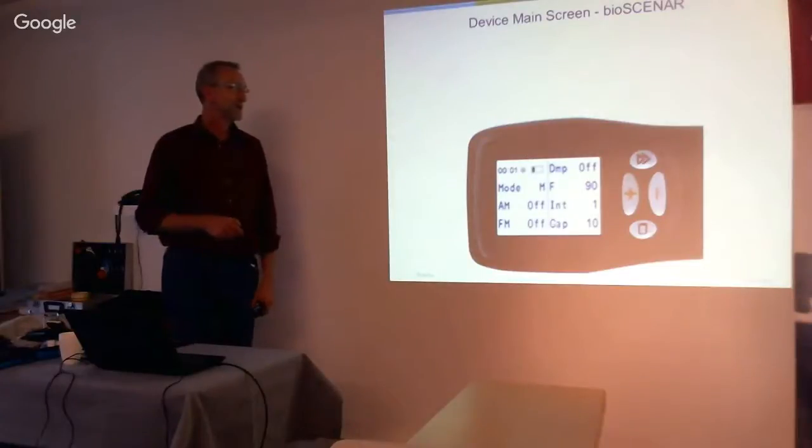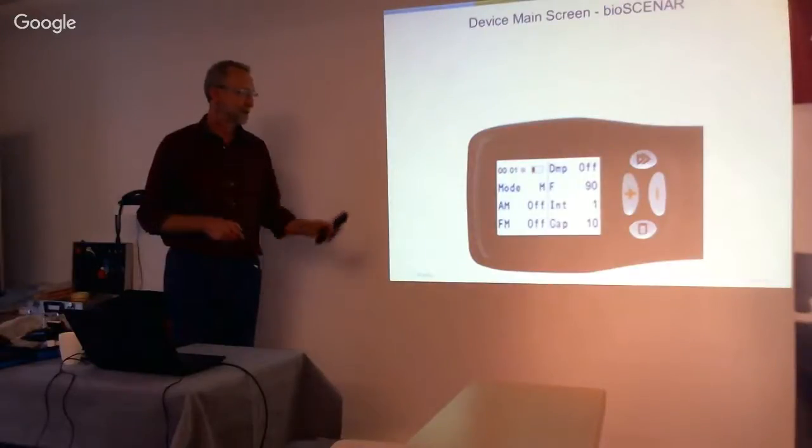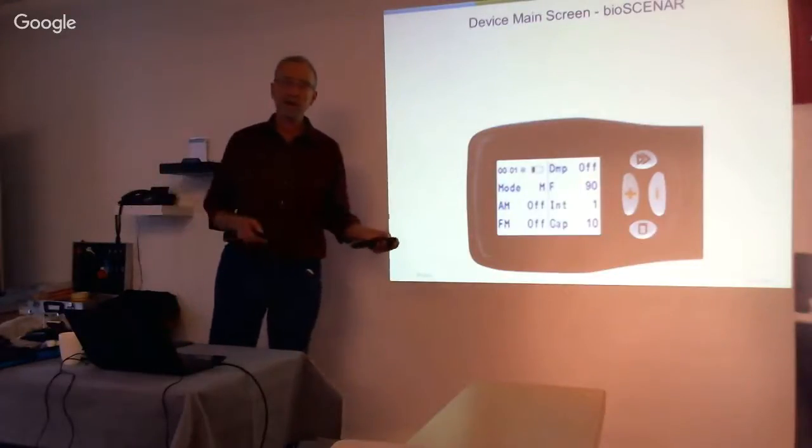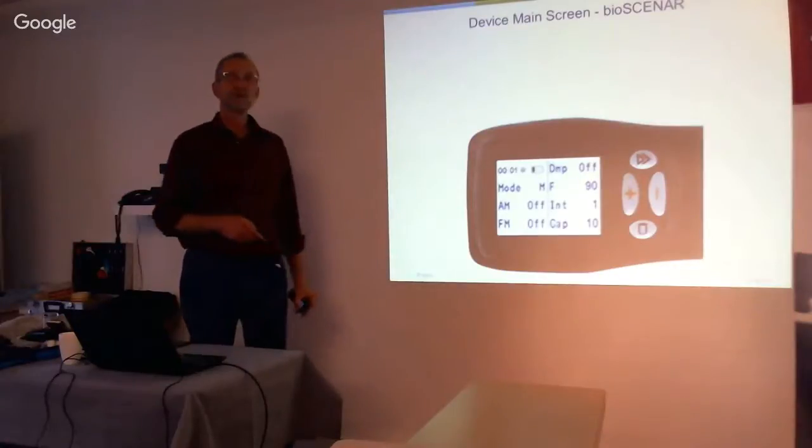The next thing you can see here is your indicator for your batteries. So it's 2/3 down, 1/3 still there. And this little field here is usually gray, but it will change its color at the very moment you are in skin contact. It is the skin contact indicator, and it changes to green.